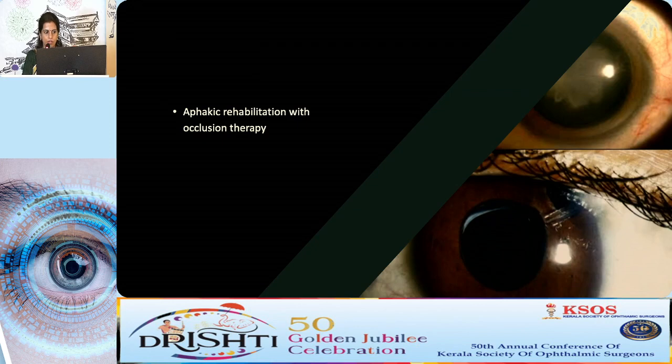This is of utmost importance, and if you are leaving a child aphakic, immediately before discharge, it is better to give the child aphakic glasses for rehabilitation. But in unilateral trauma cases, it might be different. In select cases, we might go in for a contact lens, an extended wear contact lens, but that needs a lot of expertise. So, at least aphakic glasses, so that occlusion therapy can be initiated in the immediate post trauma period.